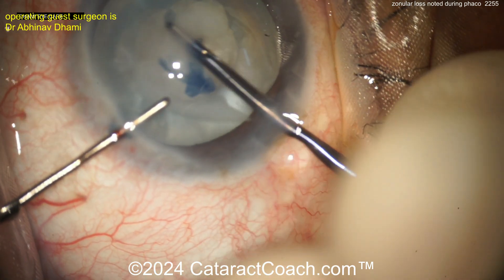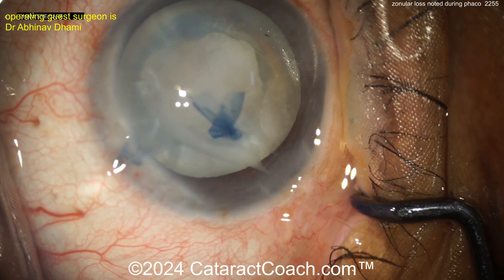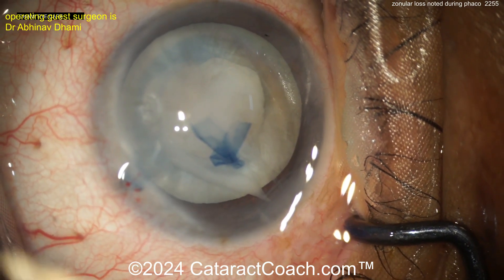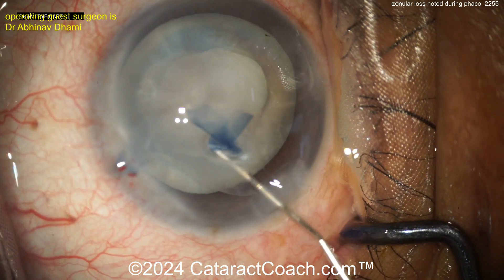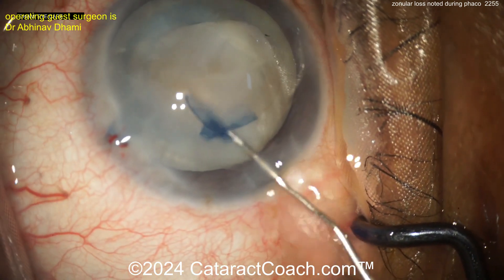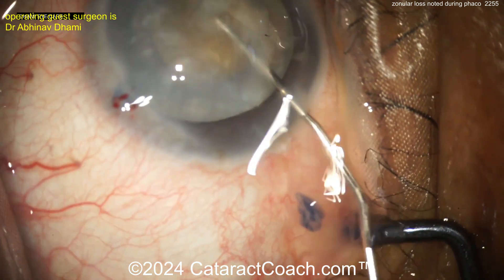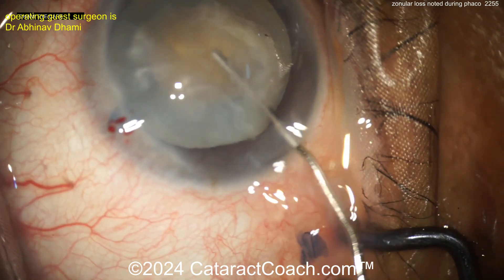Why do you still get a nice rhexis here? Why is that so easy? Well, the answer is the big nucleus is preventing the bag from collapsing. So this big nucleus is holding the bag in its correct position — so nice looking rhexis.